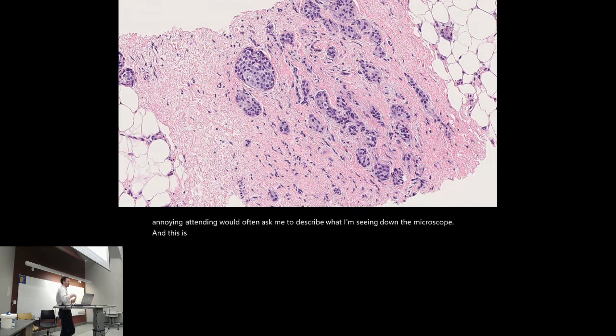This is one of the core ways you learn pathology and how to examine pathology slides. I'd have to give some morphologic description of the histologic features, the core characteristics that might communicate to my attending or to another pathologist what I'm looking at here.